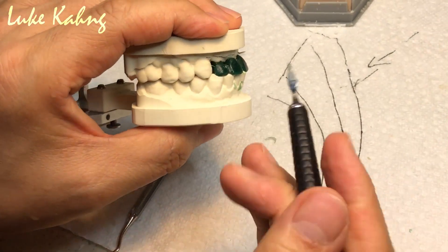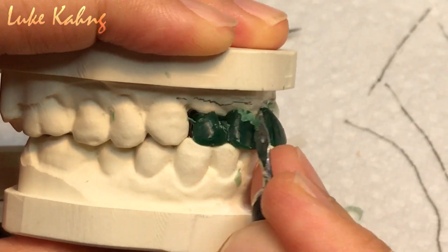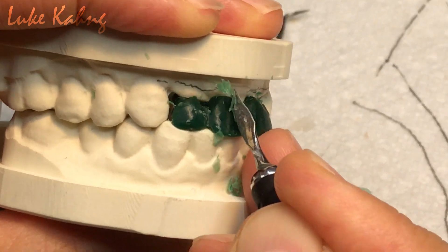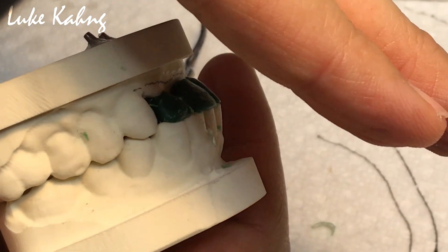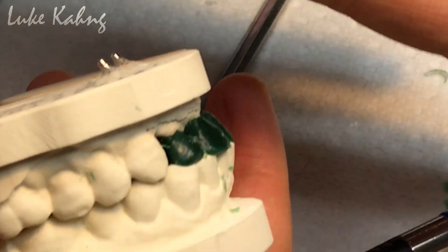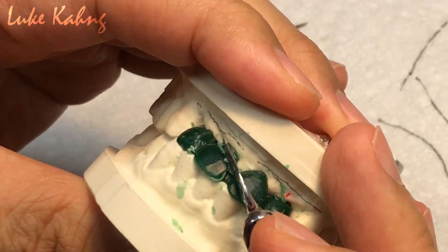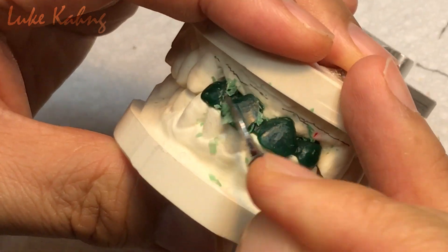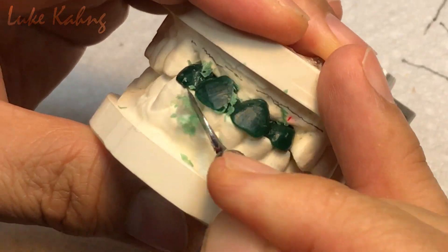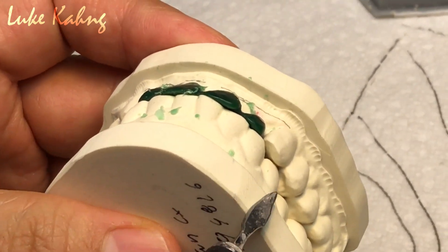So here, like this — that's what I need. So technically this, not that. So once you're done the one — see, that's what I need. That much. Now domino effect.